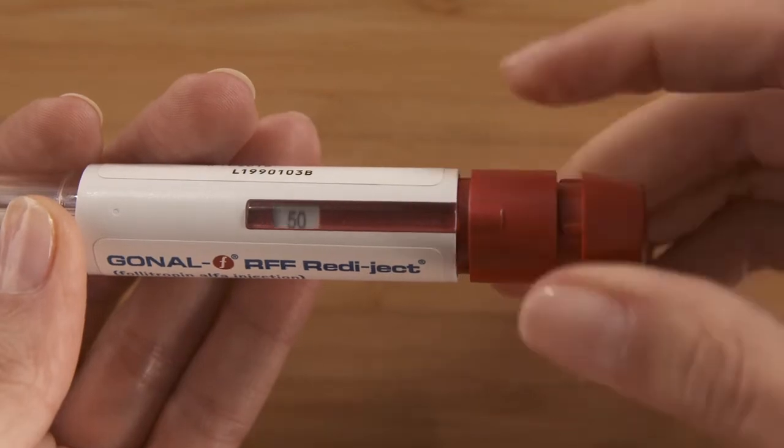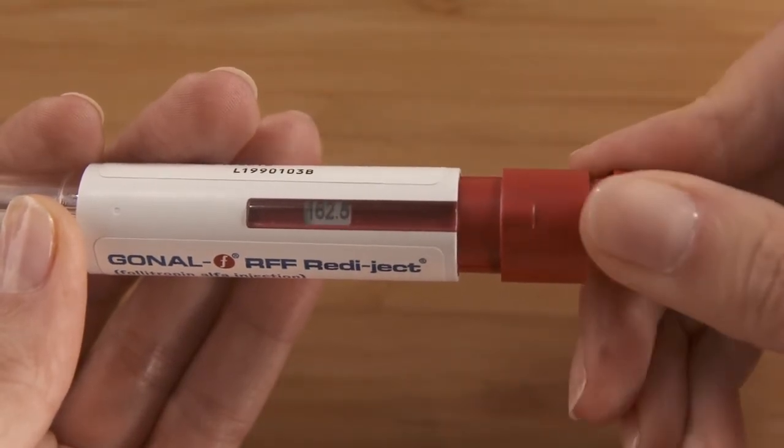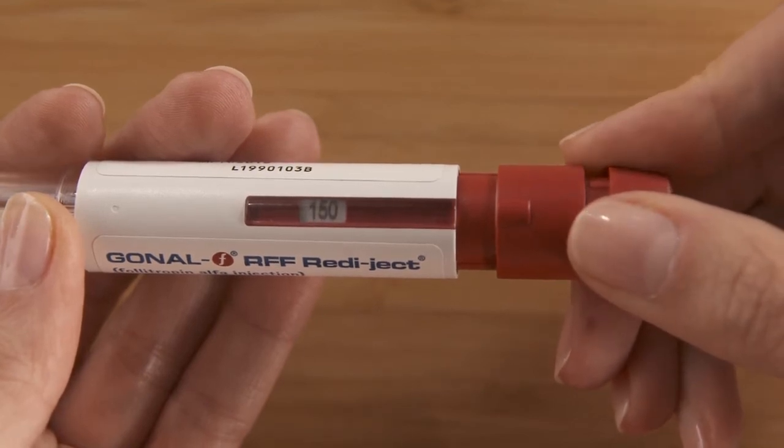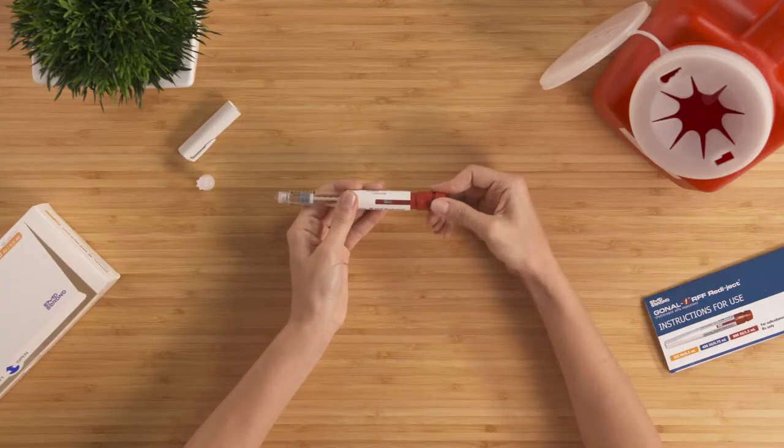Turn the dose knob until your intended dose shows in the dose information display. This is an enhanced feature of the Readyject pen with an updated display for clear legibility. If needed, you can turn the dose knob backward if you turn it past your intended dose.